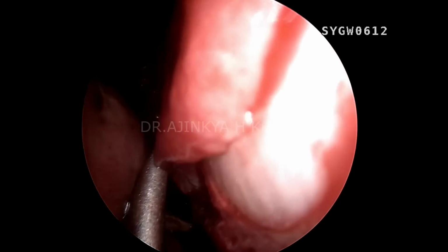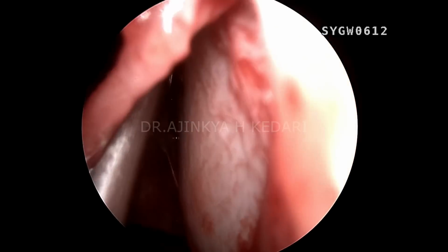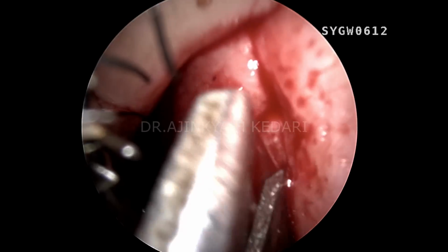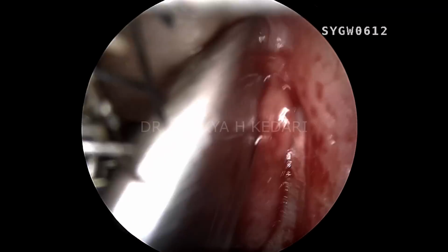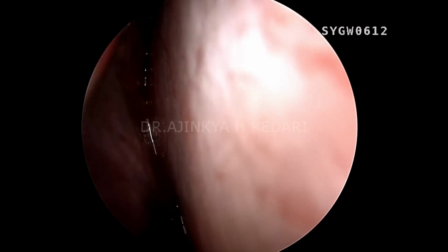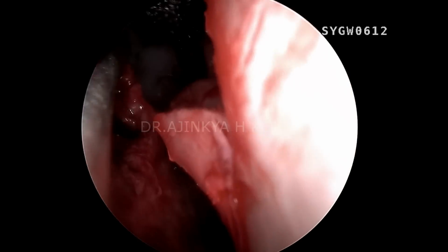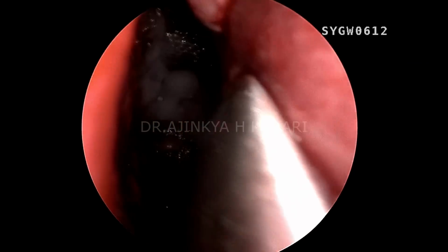So you can see that's the Hadad flap I'm taking right now with an incision with a 15 degree blade, vertical, and then retrograde I'm going to go anterior to posterior with a turbinectomy scissor. I don't use cautery for my incisions at the Hadad flaps because they tend to shrink the edges. I hate doing that. I love using turbinectomy scissors and blades for my incisions.